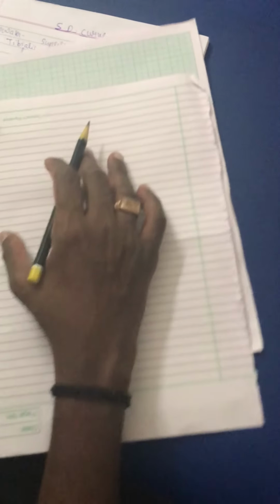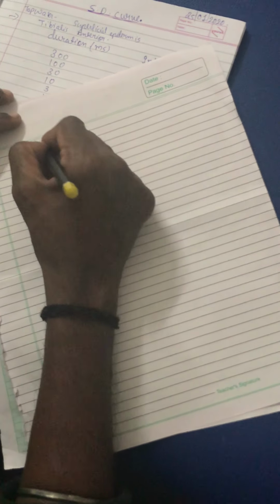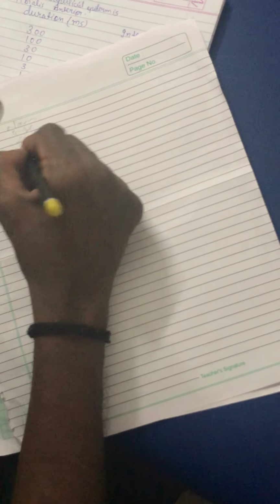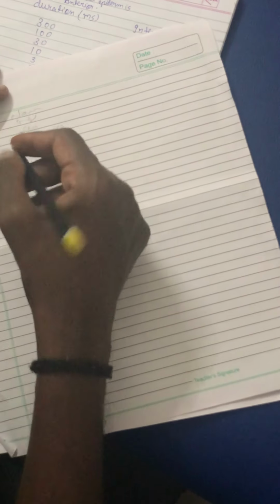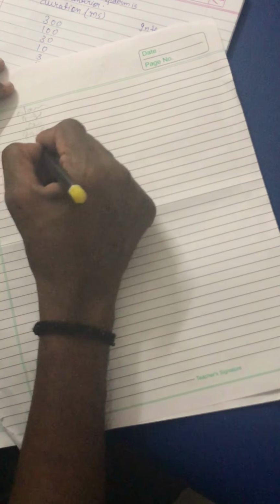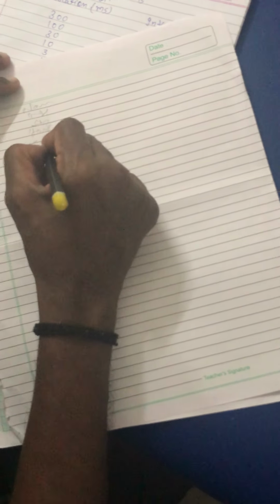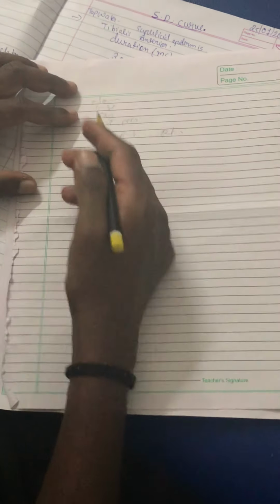Now on the other side of the graph sheet, I turn it over. Again, all the details I'm going to write: name, his demographics, hospital number, don't forget, and the muscle, tibialis anterior, and this is his right side, which is affected.